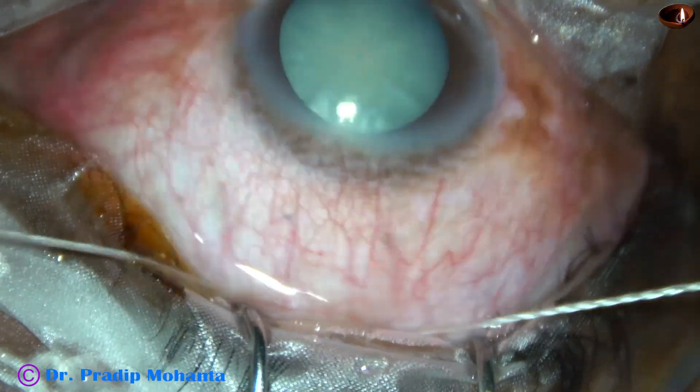The lens has to be positioned carefully because there is extension of the rhexis at around 11:30 o'clock. There is some wound gap — a large wound near the limbus — and so there is going to be high amount of astigmatism if we leave this wound unsutured. So I have asked for 10-0 nylon, and I am going to place an X suture at the center just to reduce the astigmatism.